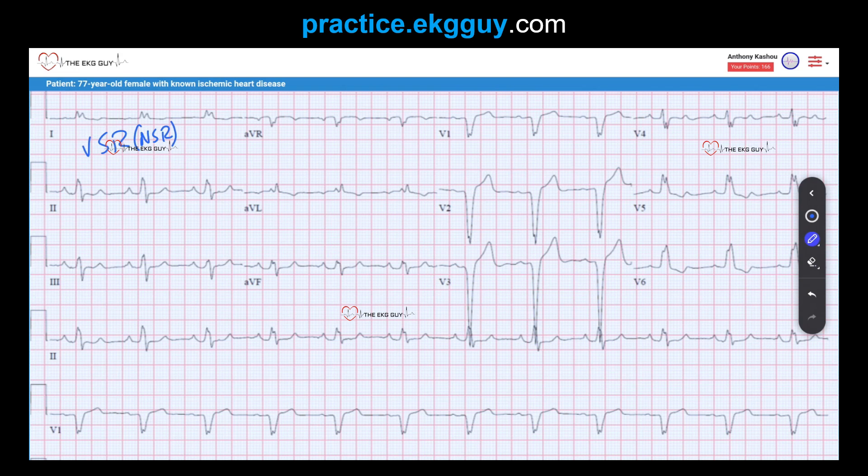If someone mentions just sinus rhythm, that infers the rate is normal. Otherwise, sinus rhythm is characterized as sinus bradycardia if the atrial rate is lower, or sinus tachycardia if the atrial rate is faster.